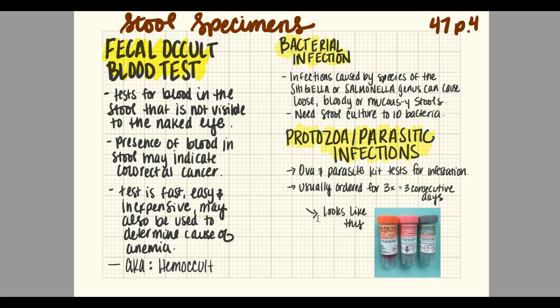There are specific instructions that need to accompany the slides to the patient so that they know not to eat red meat, that they have to collect usually 3 samples on 3 different days for 3 consecutive bowel movements, and that the samples need to not be contaminated with toilet water, with tissue, or with urine.